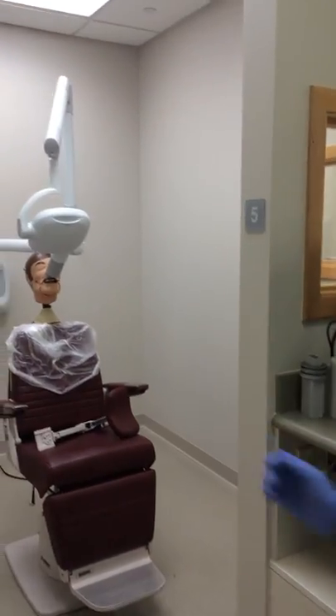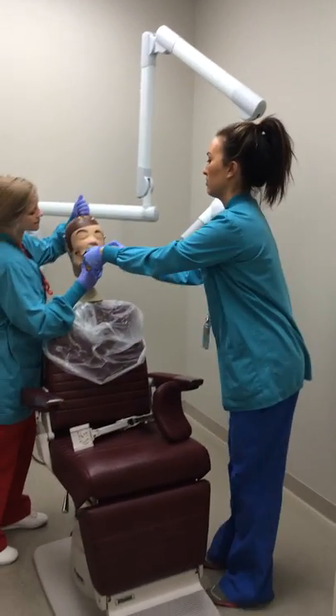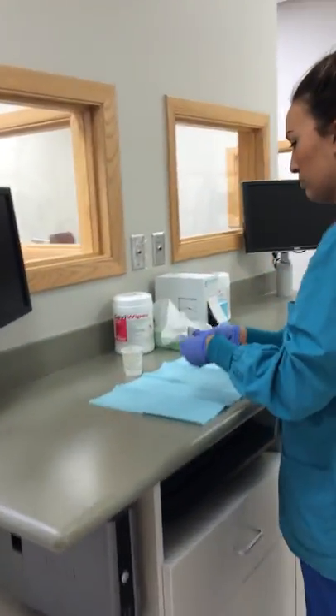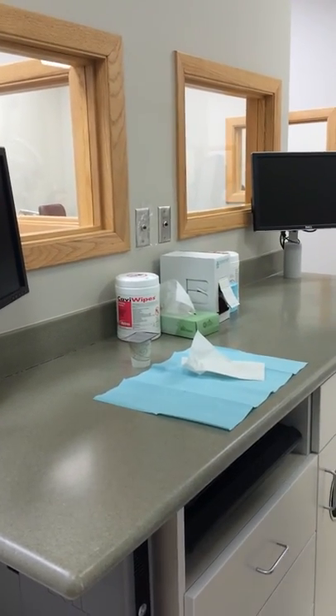Next, remove the phosphor plate from the patient's mouth and wipe with a tissue. You are now ready to view the radiograph. Keep the cup sanitary by not using gloves while carrying it.